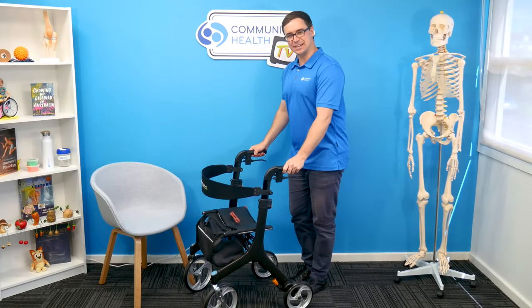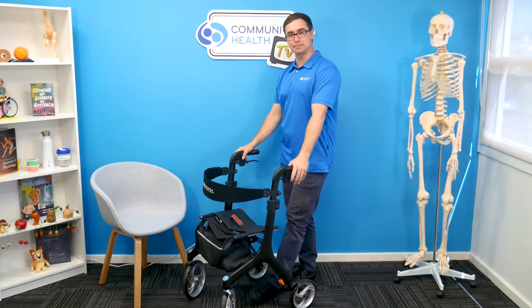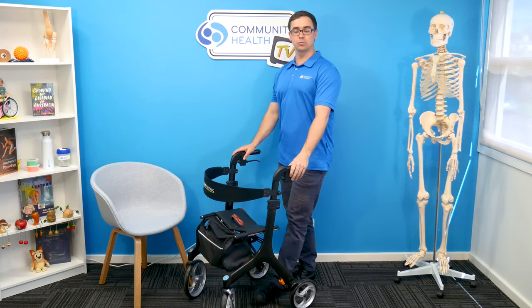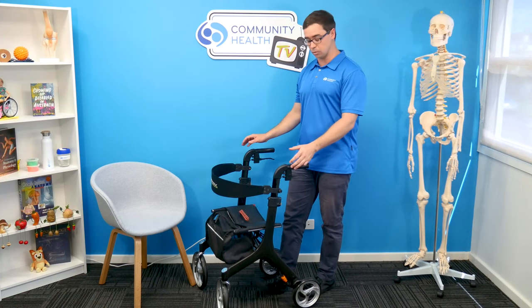Welcome to Community Health TV. Today we're talking about walkers. In particular, this model, just as an example, is the Peak Care Ellipse Walker. There are many different types of walkers on the market that our occupational therapists and physiotherapists will often be helping people decide what's suitable for them.